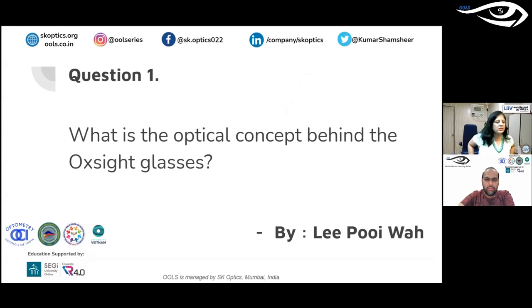I don't know if you have all seen Google Lens, augmented realities and these. So the low vision devices which are coming up in the market, eSight and others, the earlier ones were very bulky. This one was very sleek and more natural looking. What it does is, it has cameras, it has television, it converts the impulse. It is based on depth perception. The farther the object, the pixelation it will pick, and it will create that image in it. In truth, it's a lot of physics. It's a lot of new kinds of visual concepts, but it is not an optical device.